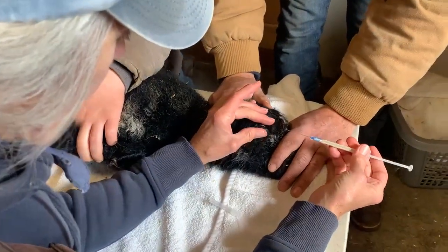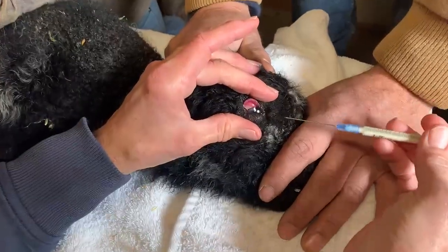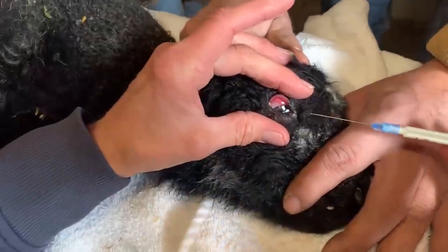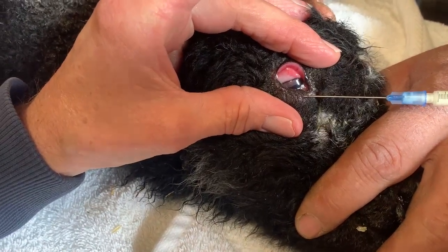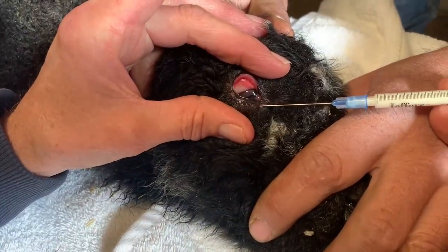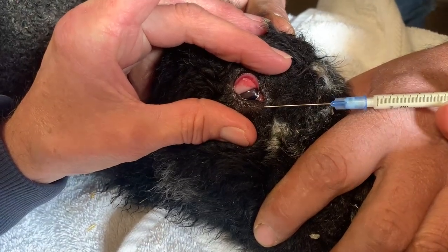I'm injecting this lamb's lower eyelid because it had entropion, a rolled eyelid. I've already injected lidocaine into the eyelid so that the eyelid is numbed. And now I have Exynel, which is an antibiotic, which is just a little more viscous. The lamb shouldn't feel the pain of this injection, and now I've got it into the eyelid.